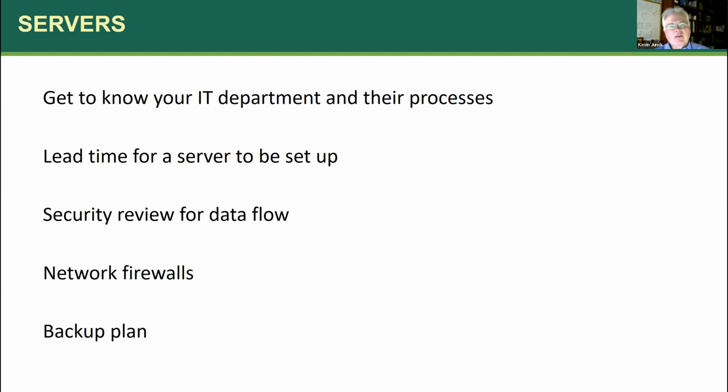So we build kind of little separate islands of equipment. The servers are on one island, and the MR scanners at our outpatient facility are on a separate island. And we've got to open up a path between those two to talk to each other. That's what the firewalls are within the institution. The idea, again, being like a firewall: if you have a fire in one area, the fire can't quickly get through to another portion and create havoc there. So we want to be able to kind of keep things walled off.